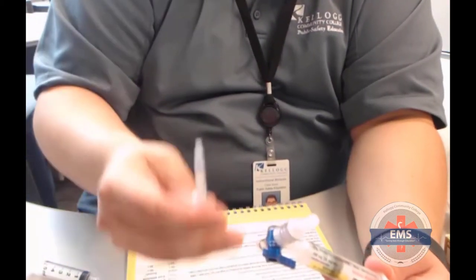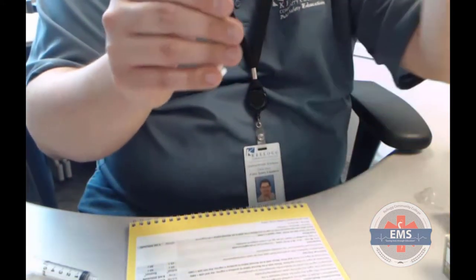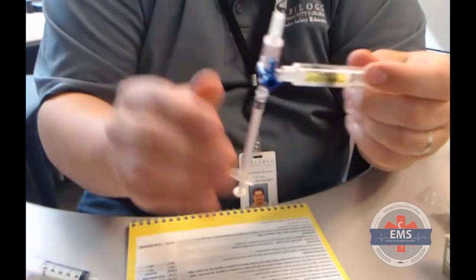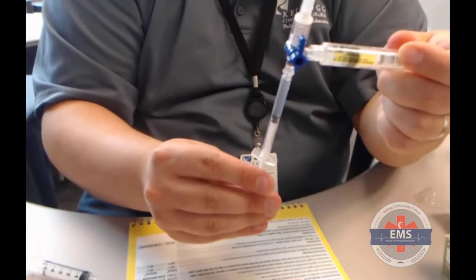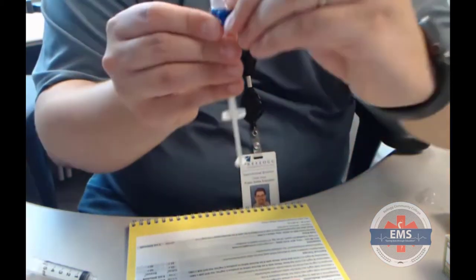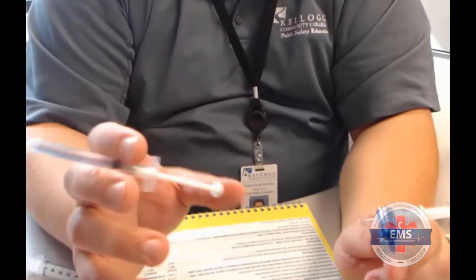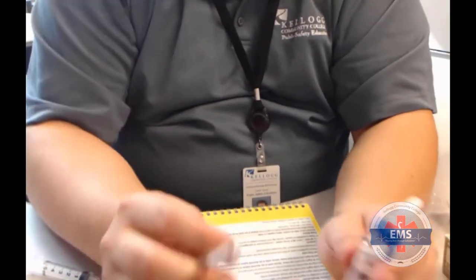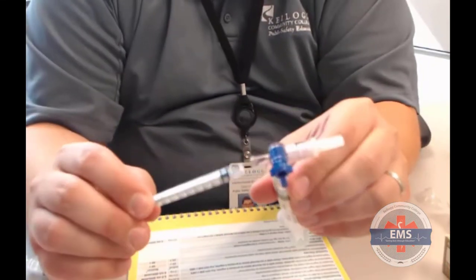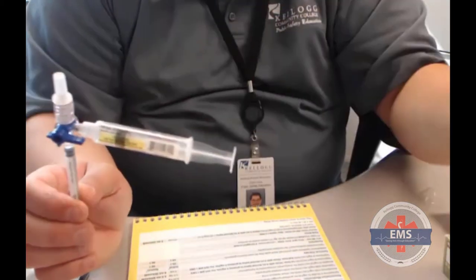Once I've given the dose, if I'm ready to draw more up, I can do the same thing for my additional dose. Take my stopcock, turn it off, and then draw myself out another 0.7, shut my stopcock off, and move my needle this way. The only other thing I could consider doing during this process, if I'm concerned about sterilization, or maybe I set this down and it gets dirty, would be to use an alcohol prep pad to clean these sites as we go. But that's a prime example of one of the ways that you could do that.